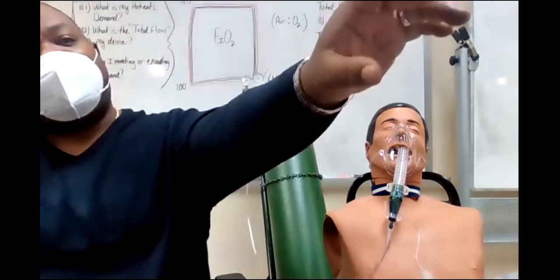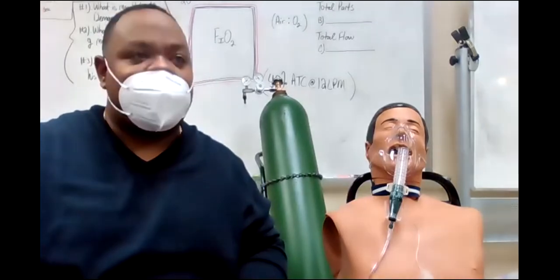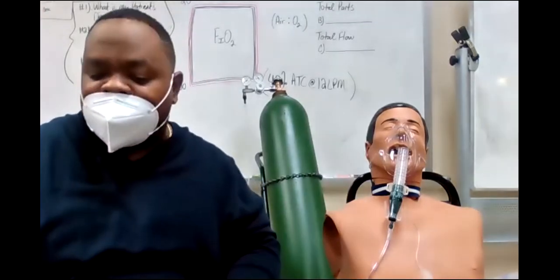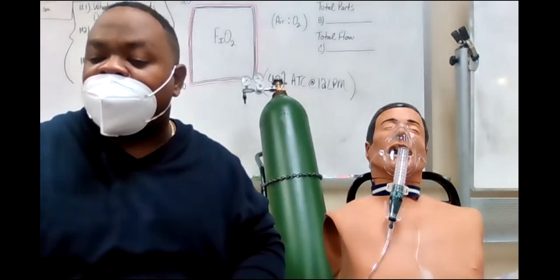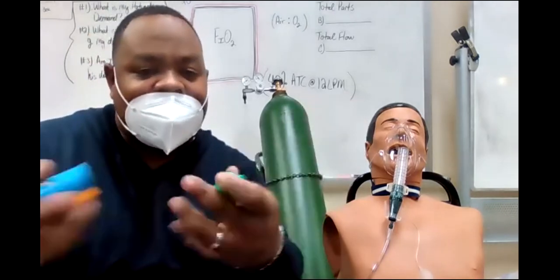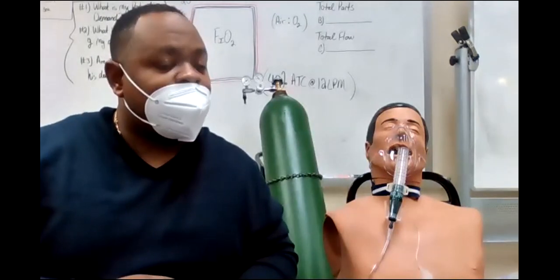He can breathe 1,000 times a minute, or he can breathe 2 times a minute. I could care less. I'm gonna give him 28%, or I'm gonna give him 50%, or I'm gonna give him 35%. Whatever it is I decide to do, that's what he's gonna get, no matter how he breathes. Understand?